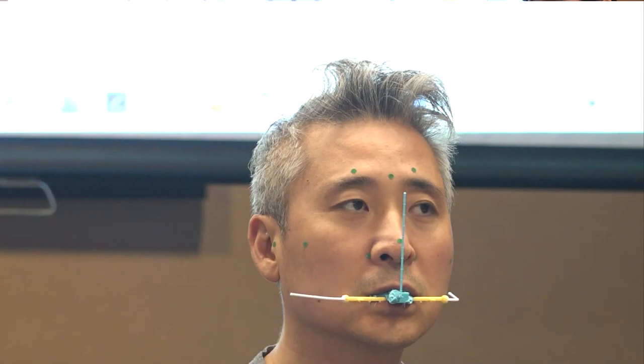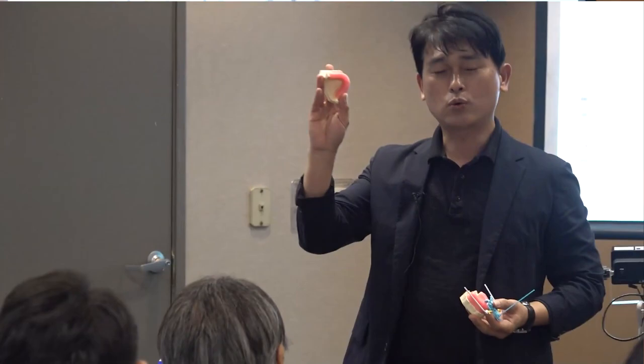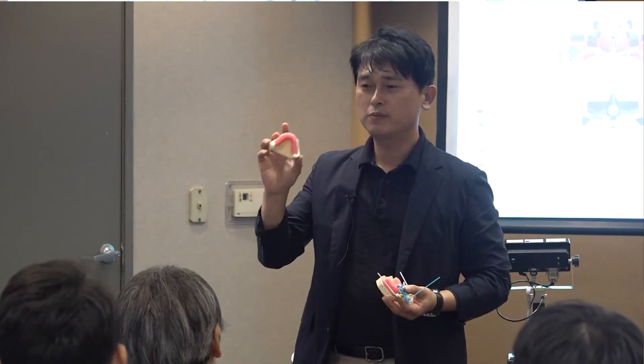Okay, open the mouth. Okay, this is a pincet. Right. So if this is an edentulous patient, the bite can be done like this. So without an adjusted occlusal rim, you can detect the occlusal plane. I know adjusting the occlusal rim is a big burden to you. So without adjusting this occlusal rim, you can take the occlusal plane directly. Okay, that's all. This is the Popo system.